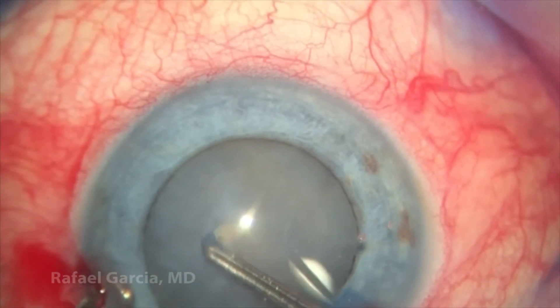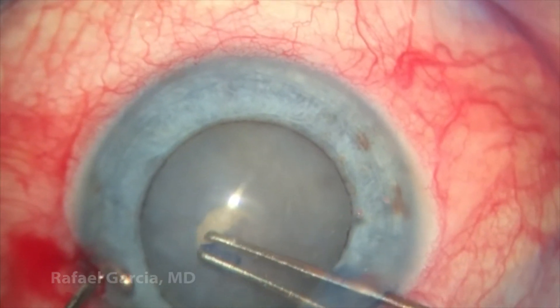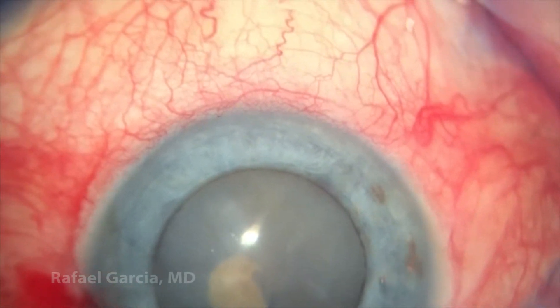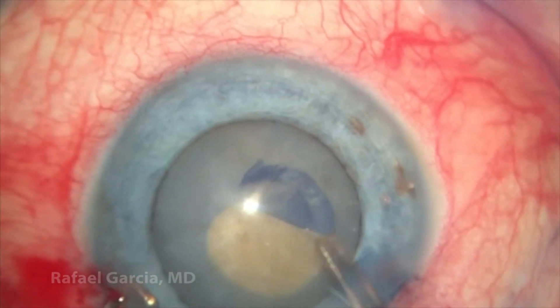A paracentesis is made and now it's time for the capsulorhexis. It's important to make a very nice and generous capsulorhexis in such cases, at least about five to five and a half millimeters in diameter, or maybe even bigger if the cataract is very dense.